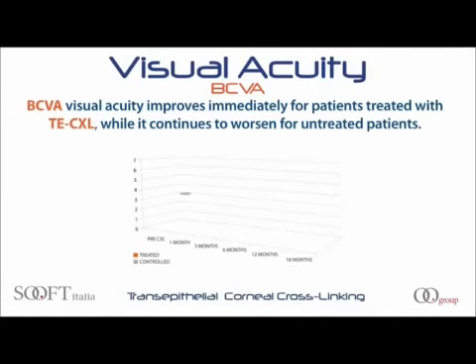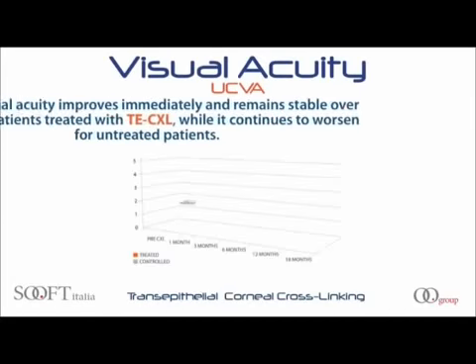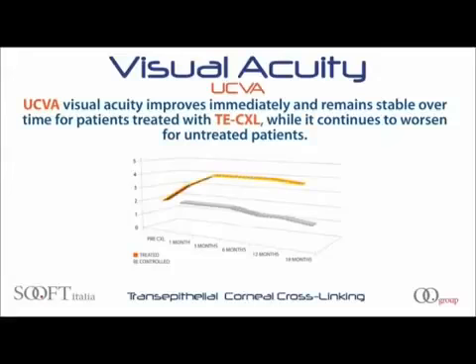Best corrected visual acuity improves immediately for patients treated with transepithelial cross-linking, while it continues to worsen for untreated patients. Uncorrected visual acuity improves immediately and remains stable over time for patients treated with transepithelial cross-linking, while it continues to worsen for untreated patients.